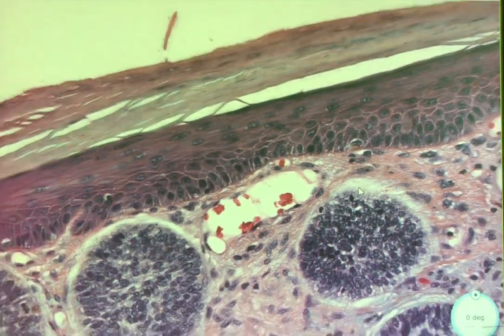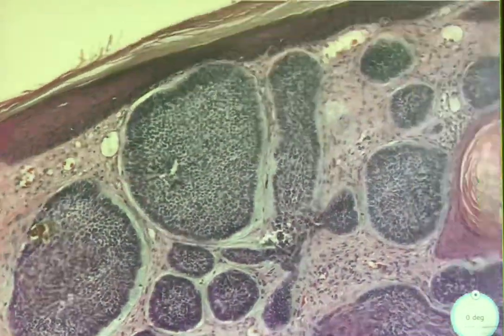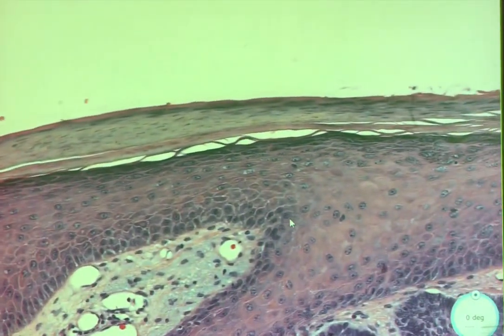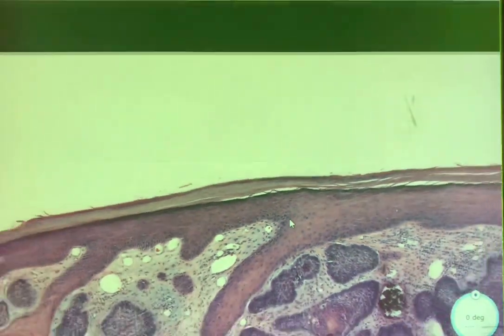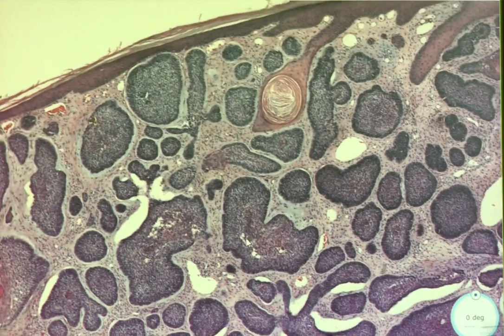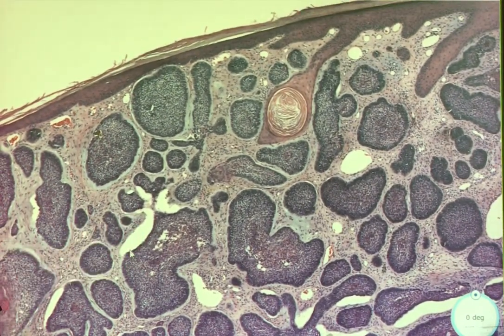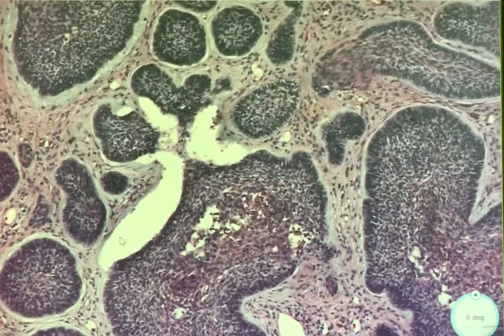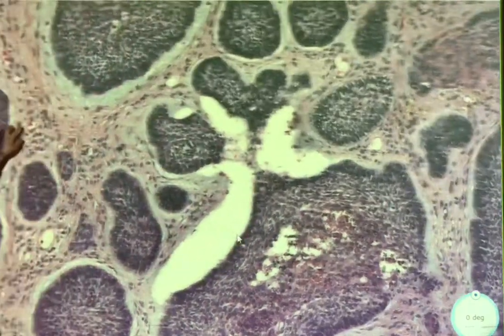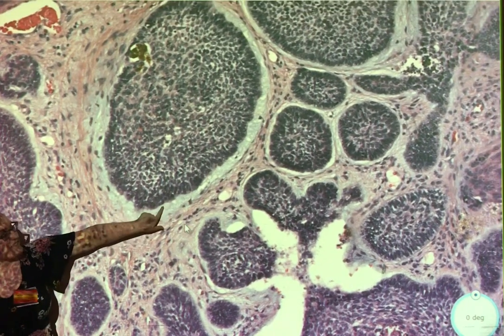But this is, for the most part, for our purposes, unremarkable epidermis. Okay. There is something else going on with the lesion in regards to how it's kind of sitting in the tissue. So do you notice all these areas? Yeah, it's like separated from it. Yeah. So this lesion loves to do that. And there's even some areas like this. It's like retraction? Retraction, yes. And some areas like this.